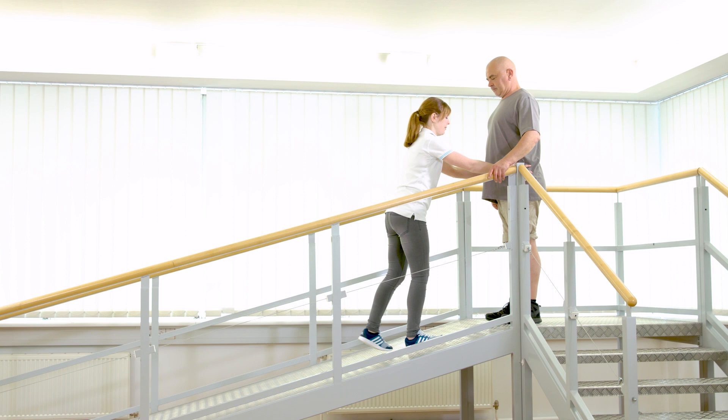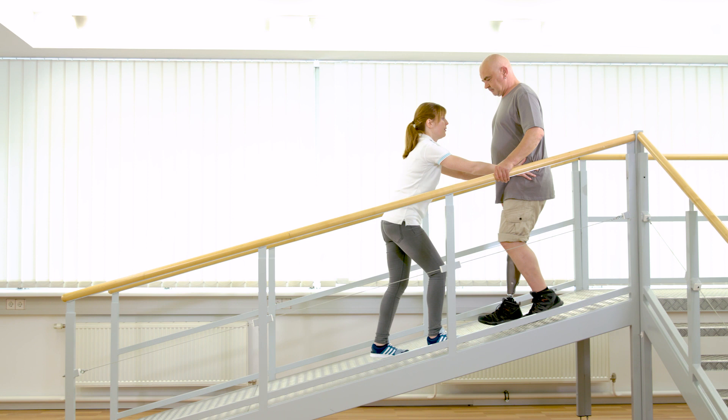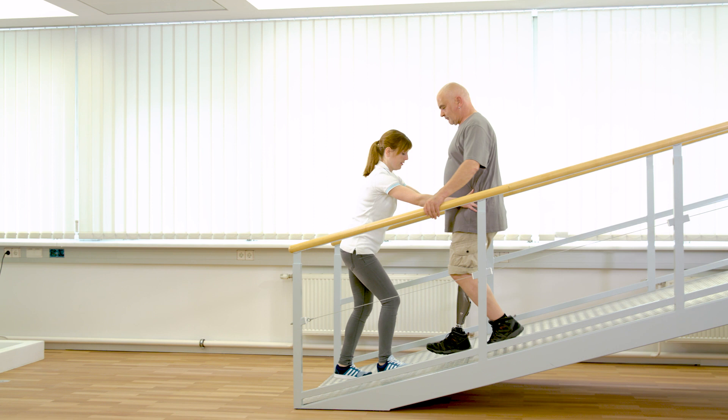Now Franziska supports the pelvis. She feels if the centre of mass stays over the foot or if the pelvis rotates. The upper body stays upright during the whole process.